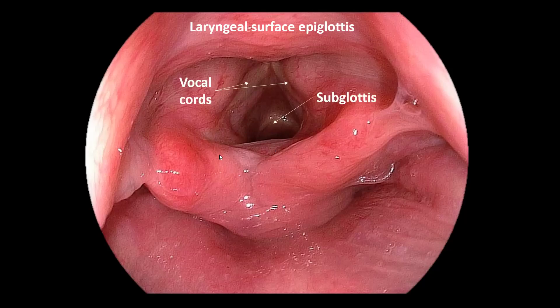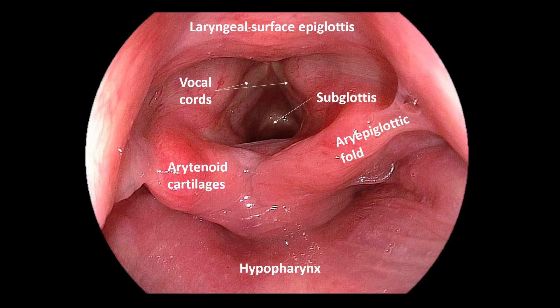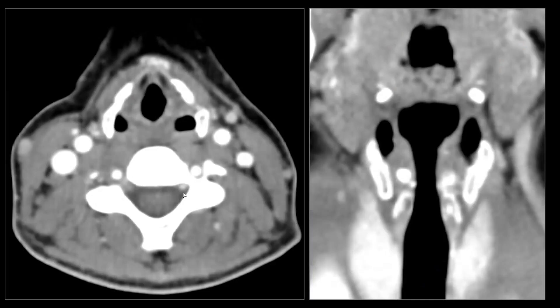Also visible are the arytenoid cartilages covered by mucosa, and a mucosal fold going from the arytenoid cartilages to the wall of the epiglottis — this is called the ary-epiglottic fold. Posteriorly we find the hypopharynx, and in the depth is the entrance to the esophagus. The recesses located on both sides of the ary-epiglottic fold are the piriform sinuses. With this in mind, let's take another look at the images to visualize all these structures.